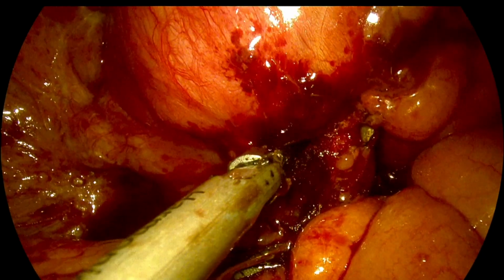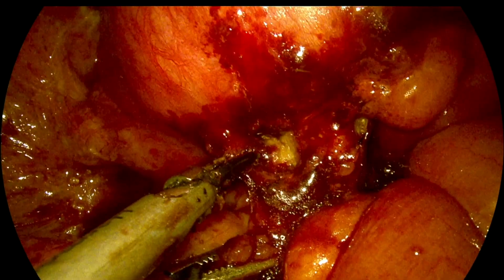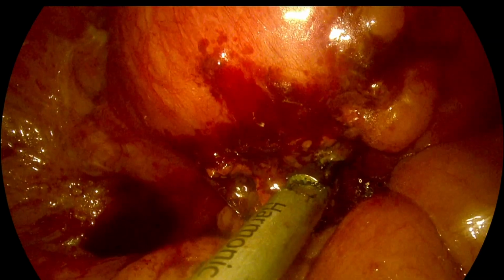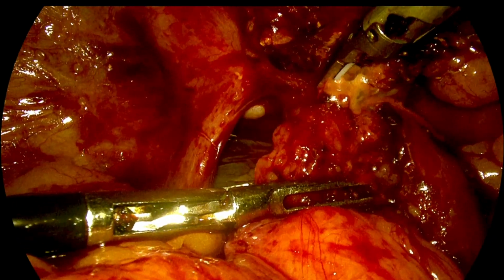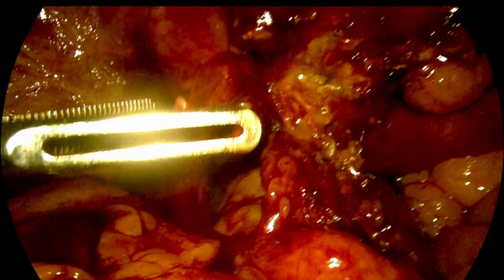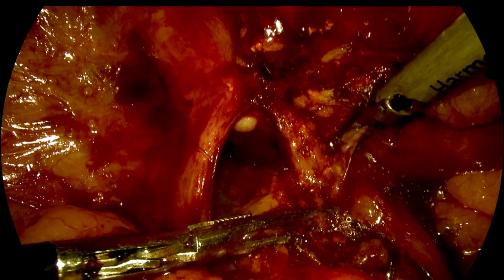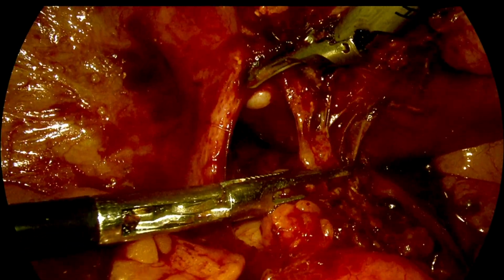So these are the sigmoid colon adhesions, as I mentioned. It is seen adhering to the posterior surface of the uterus and is being released now. Now I think the complete adhesion of the sigmoid colon is released. It is better to use an atraumatic grasper to hold the bowel and then release it close to the uterus. All this reconstruction is very, very important before we start the surgery.